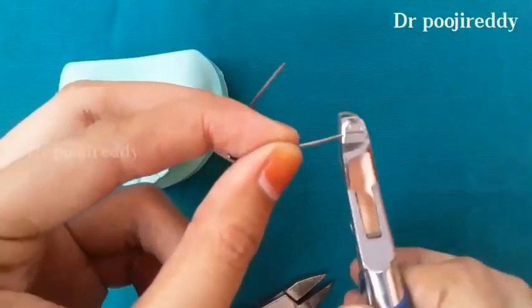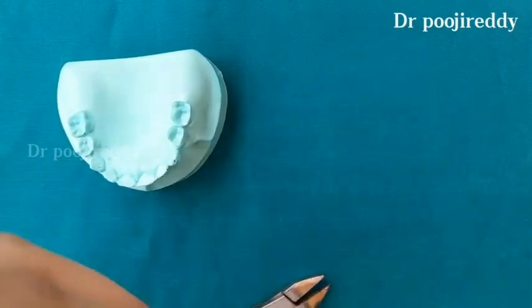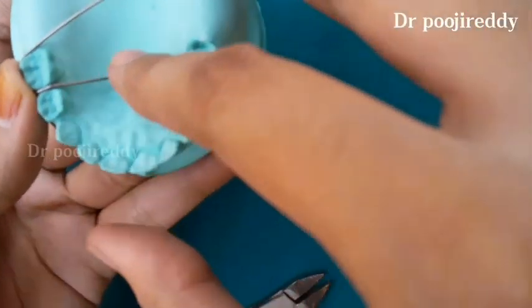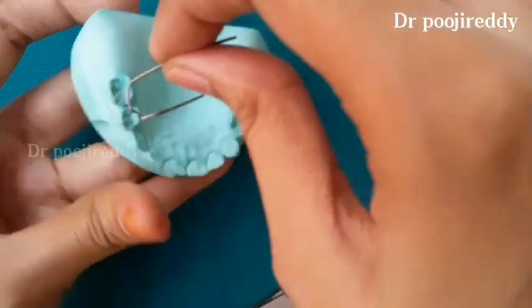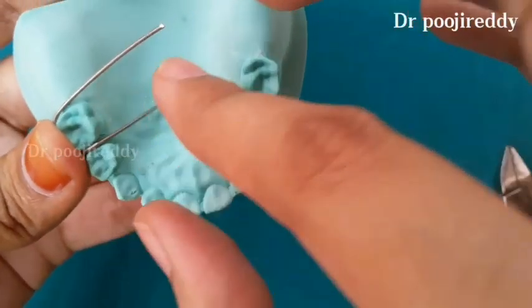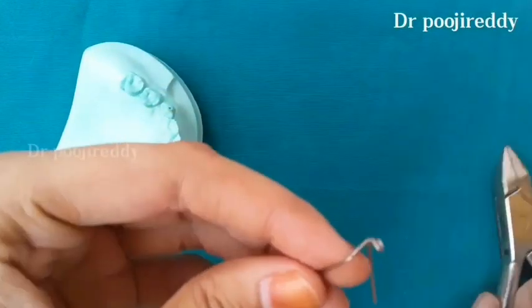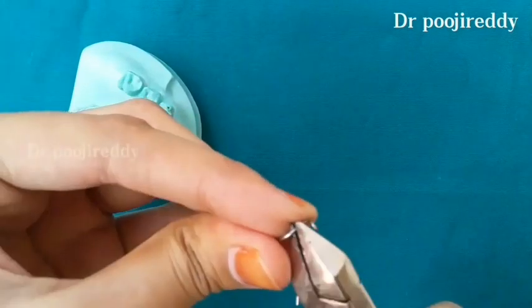Cut the excess retentive arms wire. Just adapt it well to the cast.